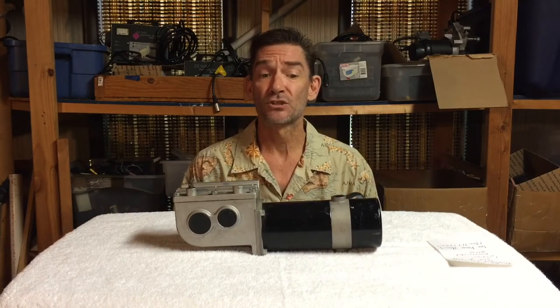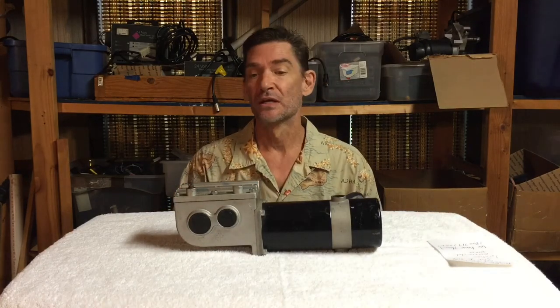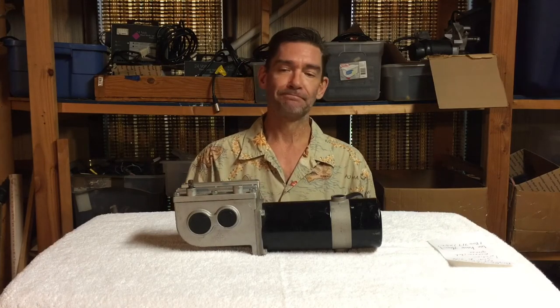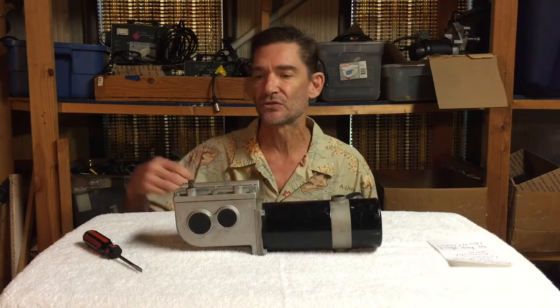If you have bad brushes you can get brushes through us; if you have a bad motor you can get motors through us. Also, sometimes people say their motor is bad because it's leaking oil.